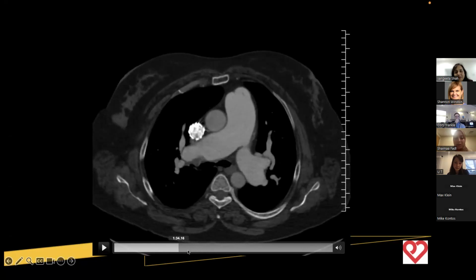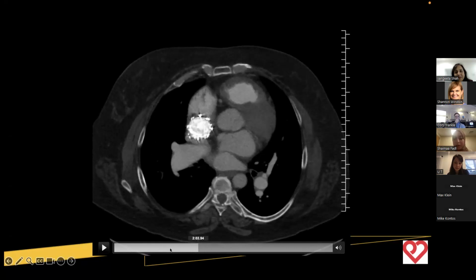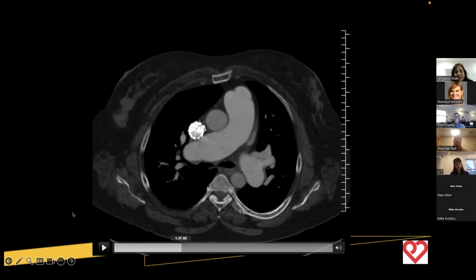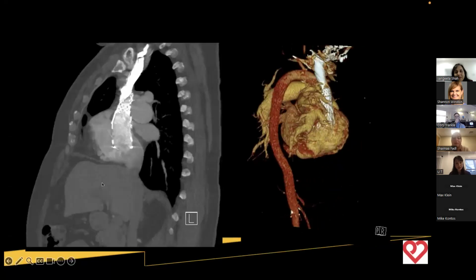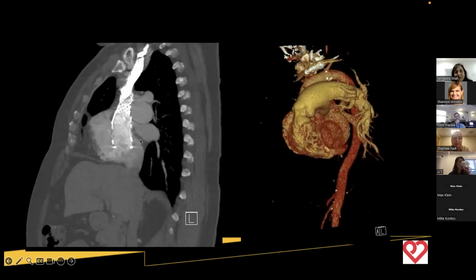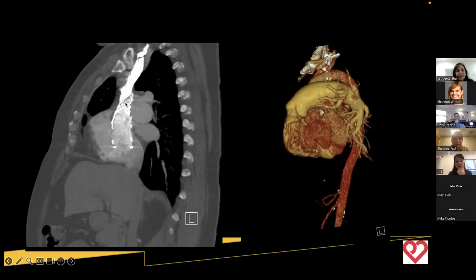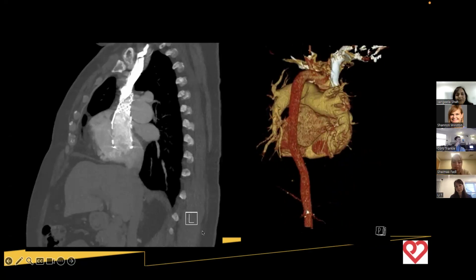It can be redirected to the left atrium, but if there is any small residual venous drainage to the right atrium, it can be sacrificed, and some patients keep it as it is. And this is the sagittal view showing the stent placement, with the interatrial septum, left atrium and right atrium, and the stent placed to cover that defect in the interatrial communication.